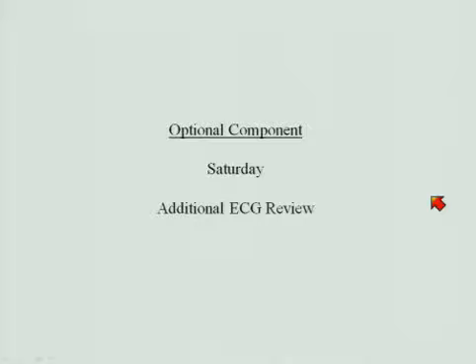So I'm not going to show you a double junctional tachycardia with retrograde and antegrade AV block at different cycle lengths. We're going to talk about fundamental things that you all see every day or every week and are able to identify. So first of all, for the certifiers, a couple comments about the ECG test. The first point to make is that it is not the ABIM's intent to trick you. It's made up of people like you and me. The board are practicing and academic cardiologists who sit around a table and go through the electrocardiograms.